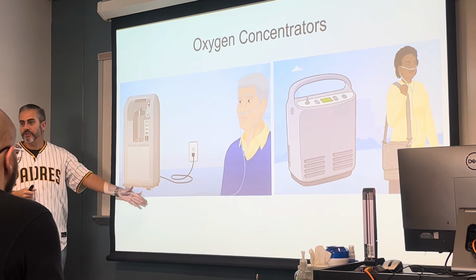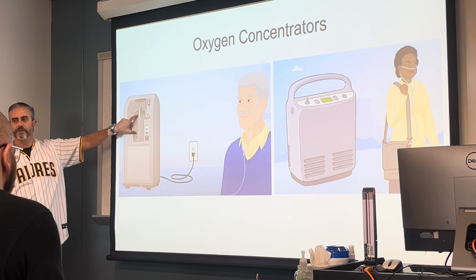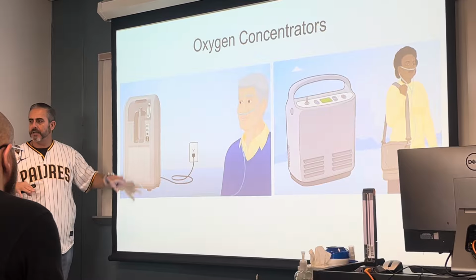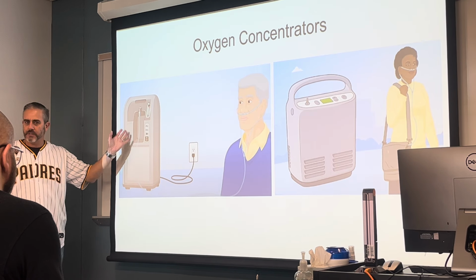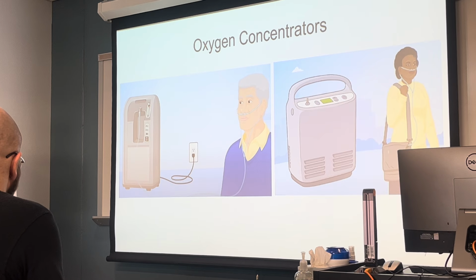And so our patient's nasal cannula connects to the flow meter here. We can even attach a bubble humidifier here if necessary. Liter flows for these are not exceptionally high, sometimes only going from 1 maybe up to 5 liters tops. But it's enough to supply a patient some low flow oxygen in a home care setting.